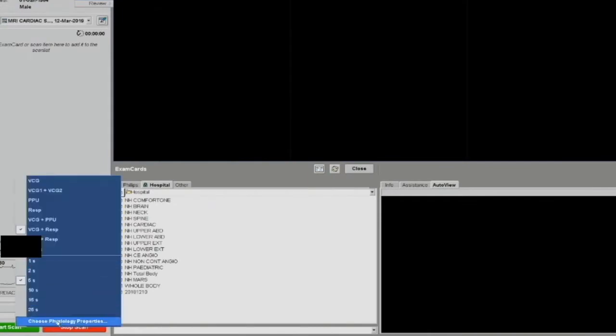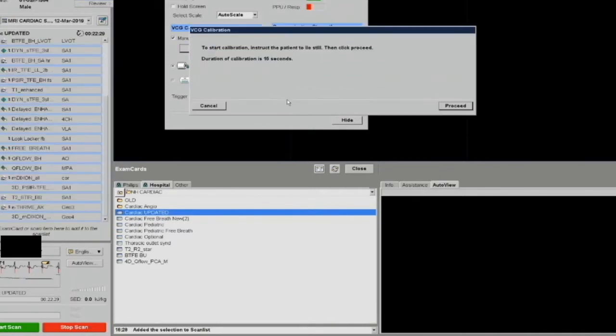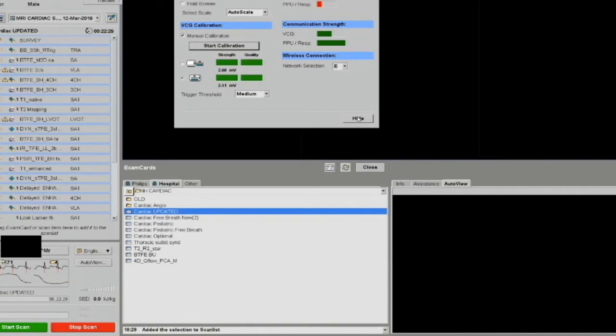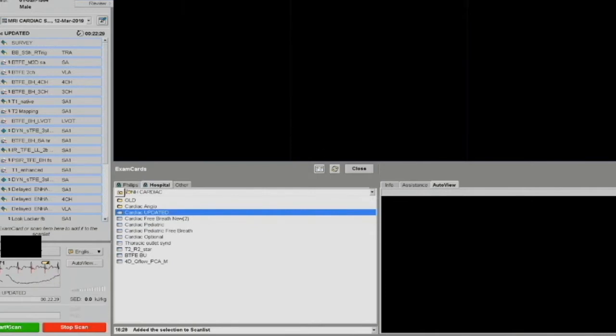The first step in doing a cardiac MR is obtaining good ECG and respiratory gating. For ECG gating, we do something called calibration. Calibration is needed because inside an MR magnet, the ECG waves undergo certain changes, making it difficult for us to interpret the ECG. What calibration does is make sure we get a sharp and tall R wave, which will act as a trigger for the ECG gated scans.